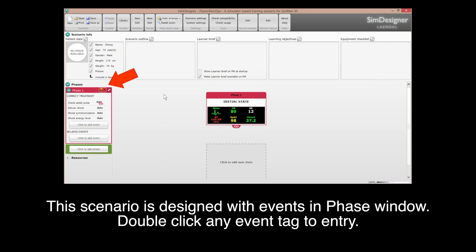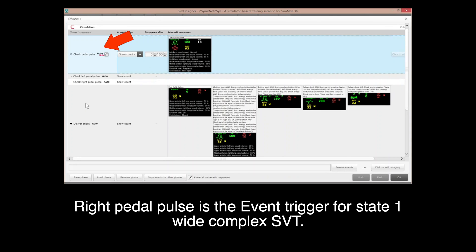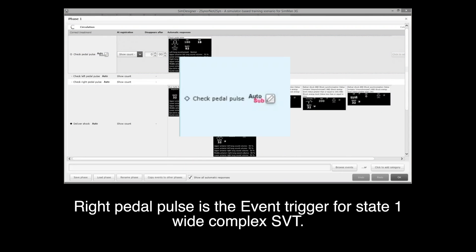Overview of the programmed scenario for simulation needs with scenario programming portfolio. This scenario is designed with events in a phase window — double-click any event tag to enter. The right pedal pulse is the event trigger for State 1: Wide Complex SVT, Supraventricular Tachycardia.